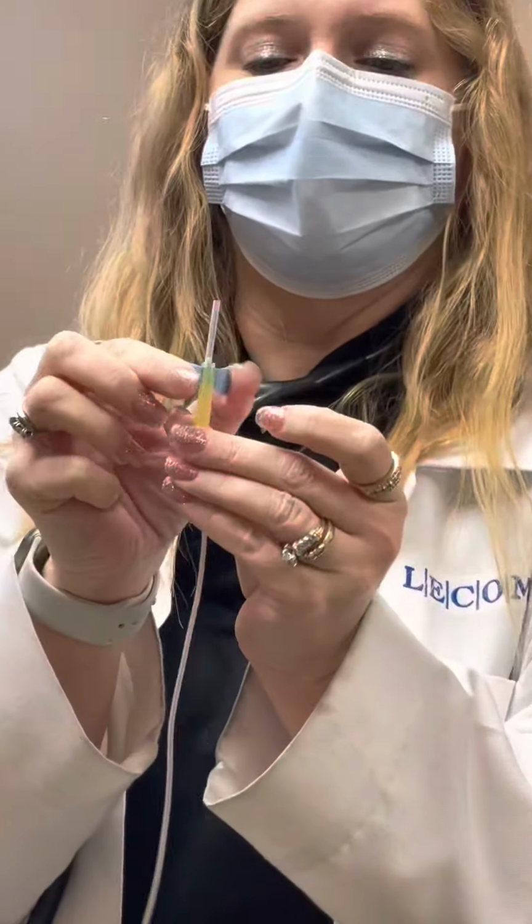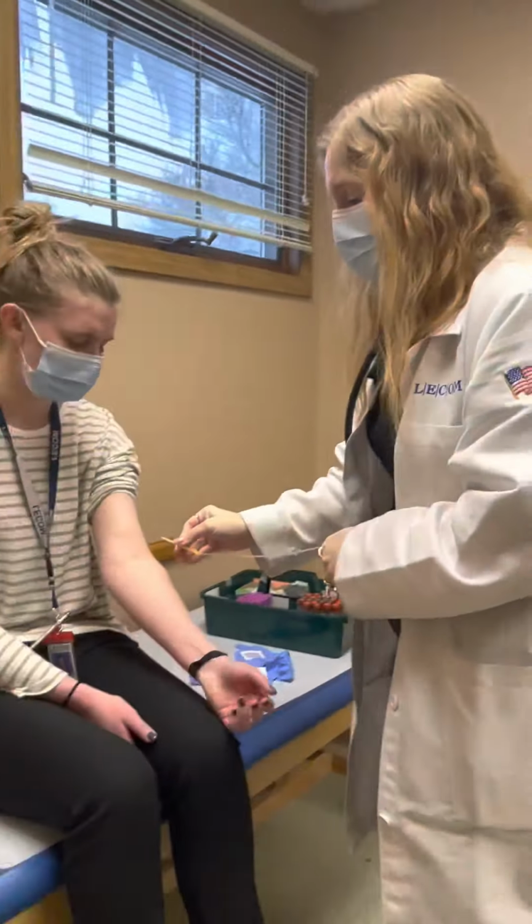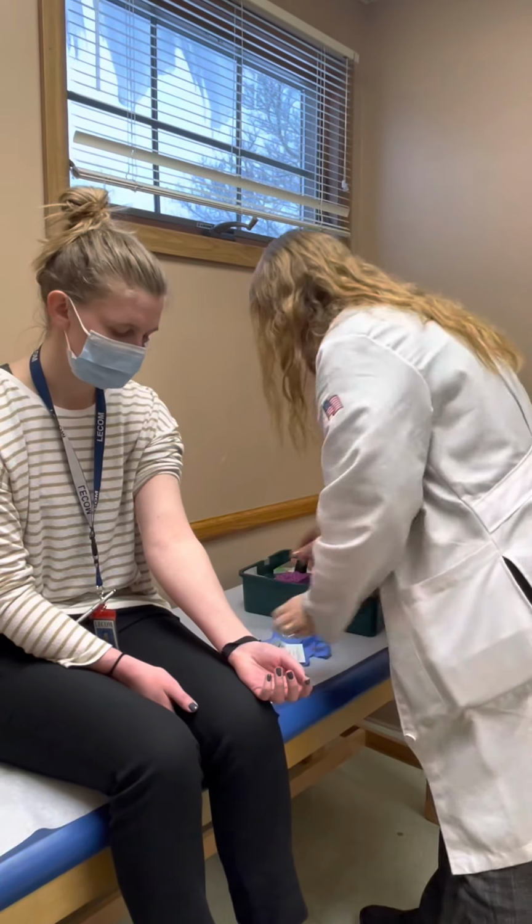Then this is the end that you're going to be drawing with. This is called a butterfly needle, and you see these little grippers? That is what you're going to grip. This is how we're going to go in. When you go to draw blood, you're going to go at a 15 to 30 degree angle depending on how deep the vein is. All right, so that's the first part.